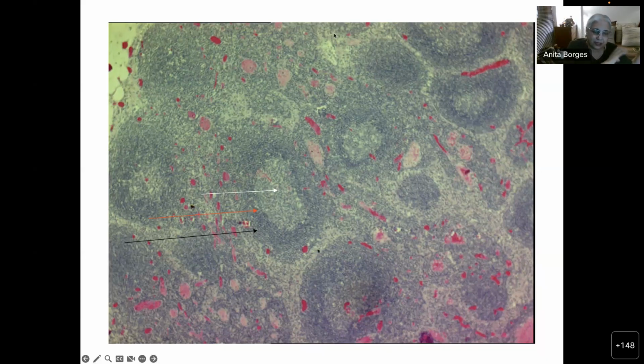Although, as I said, we are now talking about follicular helper T cell lesions, and some of them actually have a follicular appearance because they are within a follicle and they're growing within a follicle. Okay, so number one, by usage, it should have B cells.